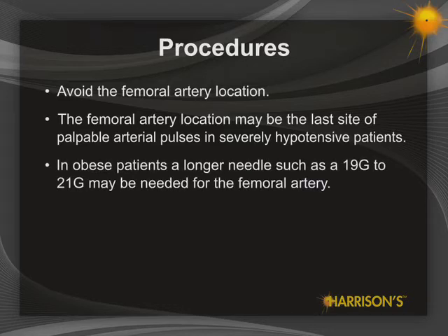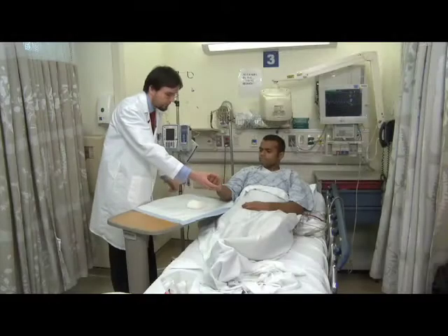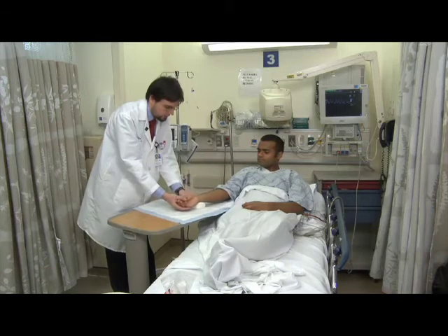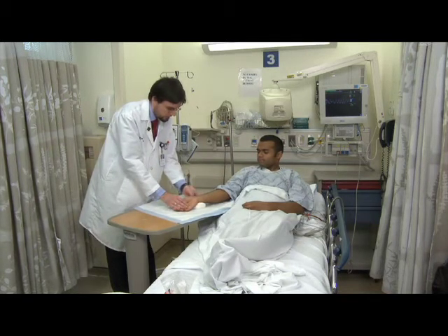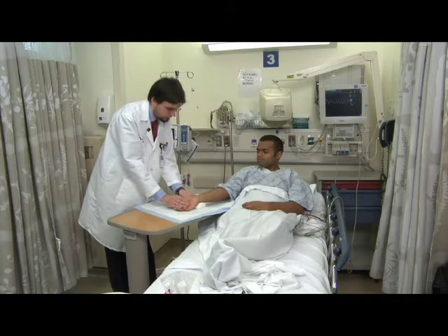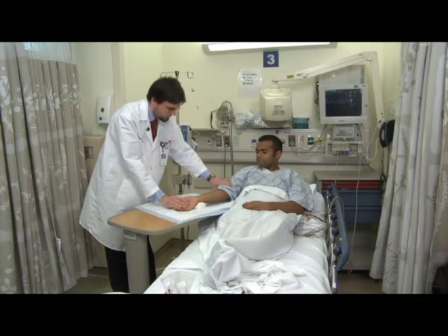In obese patients, a longer needle, such as a 19 gauge to 21 gauge needle, may be needed for the femoral artery. Ensure a quiet environment, limiting distractions with good lighting. Explain the procedure to conscious patients to reassure them and avoid hyperventilation.